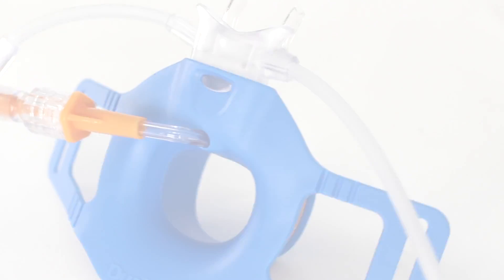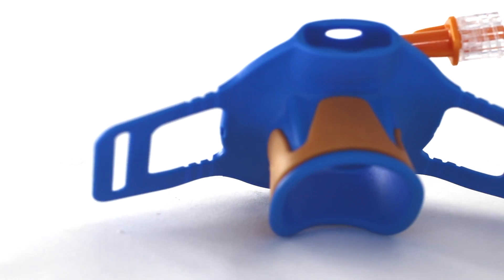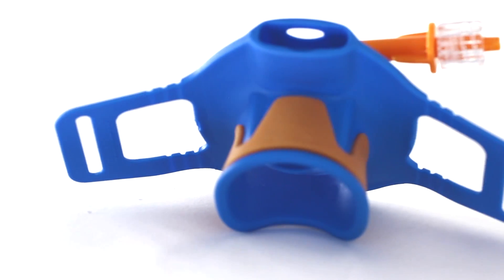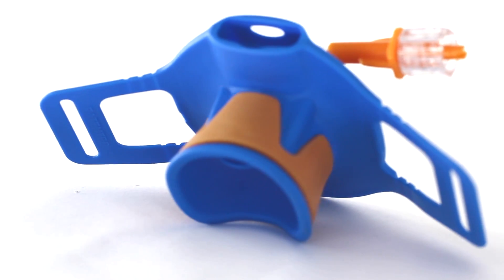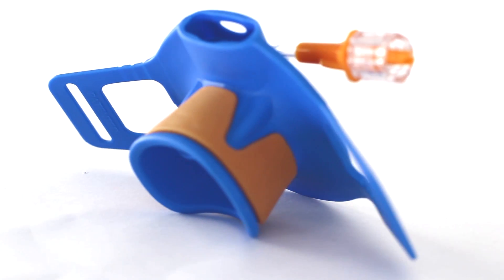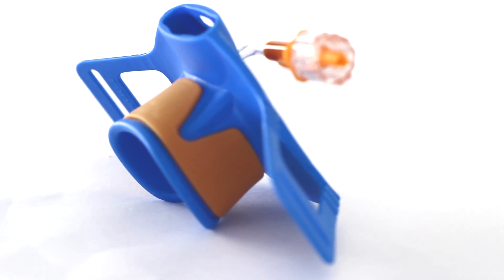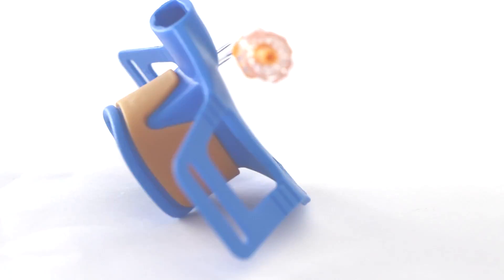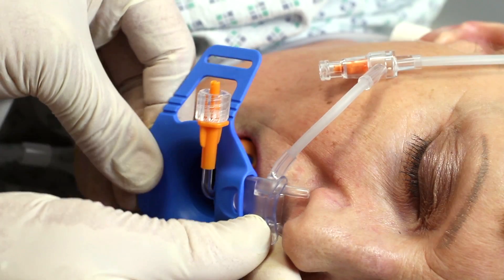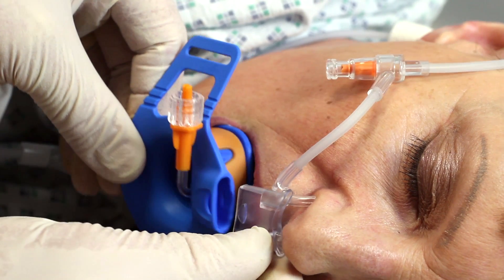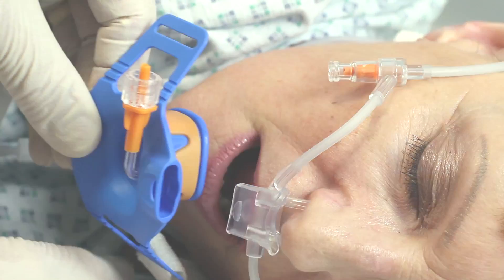Dual Guard's Comfort Rest bite block has a soft over-molding that protects the patient's teeth from damage and provides ample maneuverability for clinicians to pass an endoscope. After the procedure, Dual Guard's detachable nasal cannula remains with the patient.